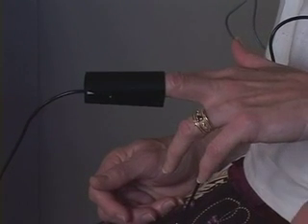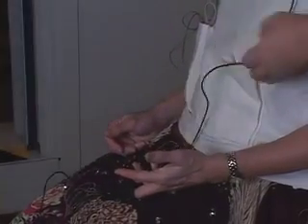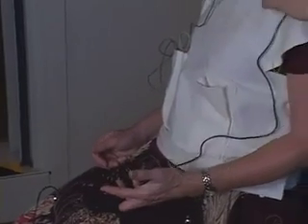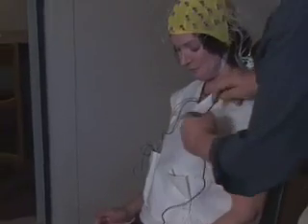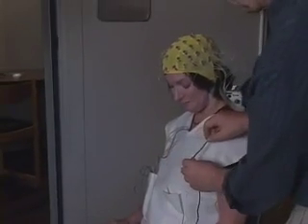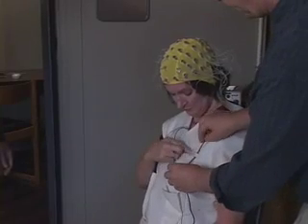There we go. I'll take up the excess slack here through the vest. And there we go. How are you doing there, Kate? That's very comfortable. Okay, would you like to secure this through that Velcro strip? There we go. Great. And that's that.